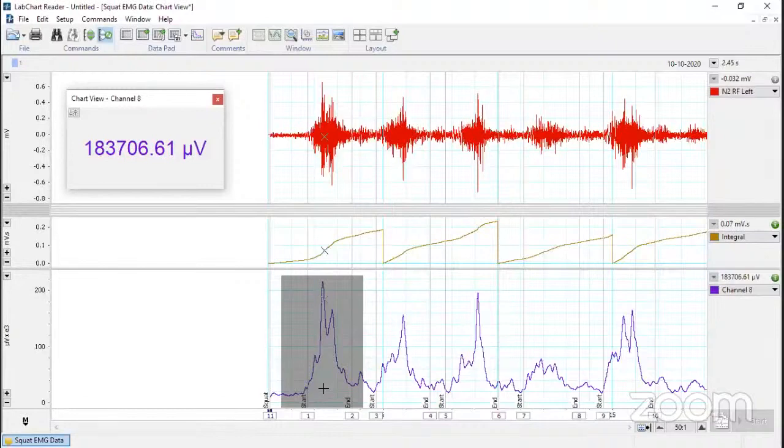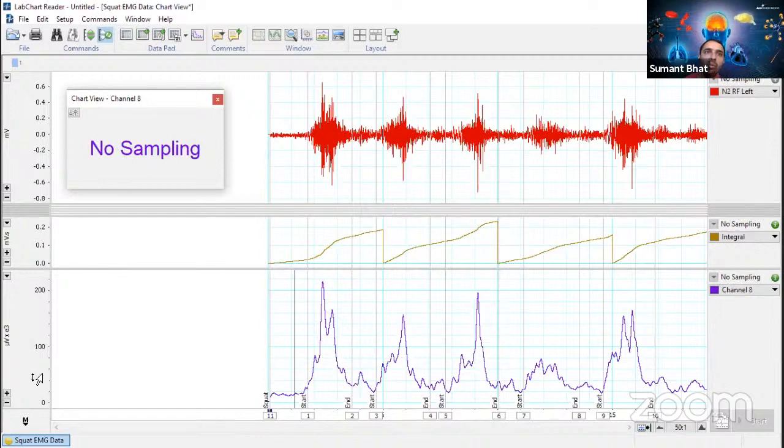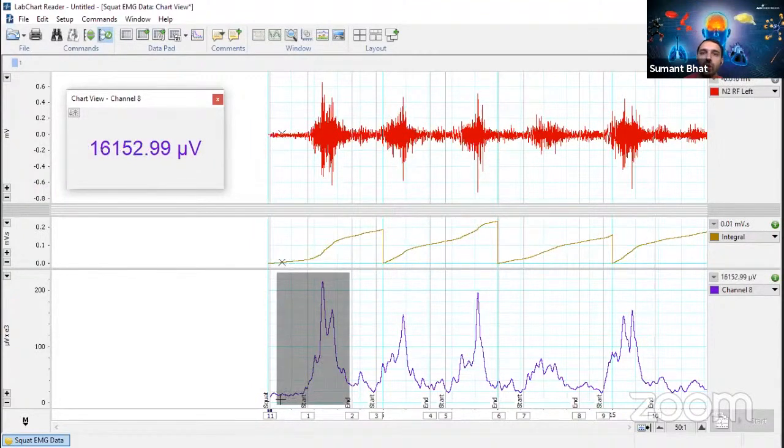When recording isometric contractions for standardization, we advise a rest period between two successive contractions. Irrespective of the challenges, we will see how to actually get the MVC from this RMS. It can be applied to one of the trials or to a separate one. The RMS is showing in absolute values — millivolts. We will choose one of these waveforms as MVC — we need to consider the baseline as 0% and the peak as 100%, calibrating for that particular set.